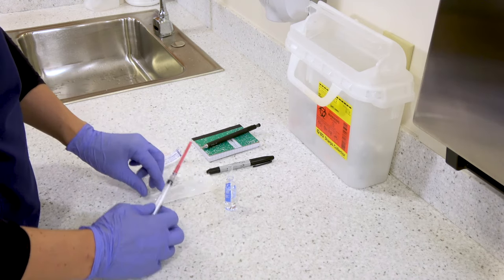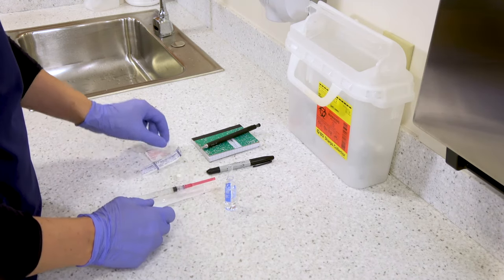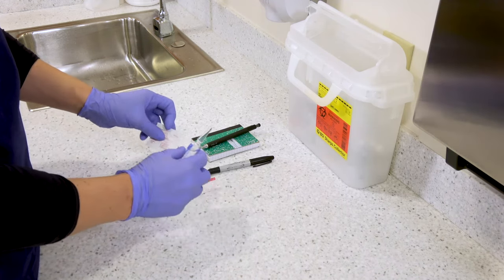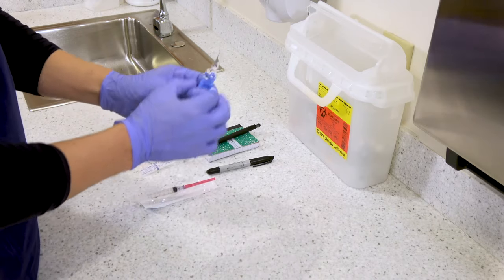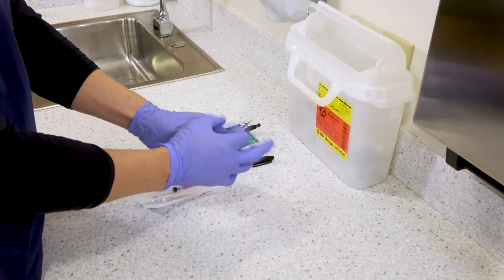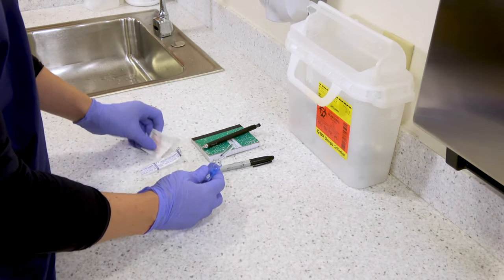Once you've attached your filter needle, you want to hold the ampule in your non-dominant hand and make sure that you get all the bubbles out of the top of the ampule. You can flick it or you can tap it on the table gently.